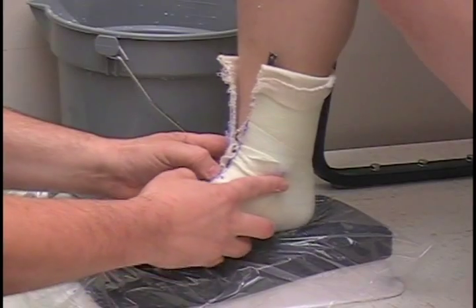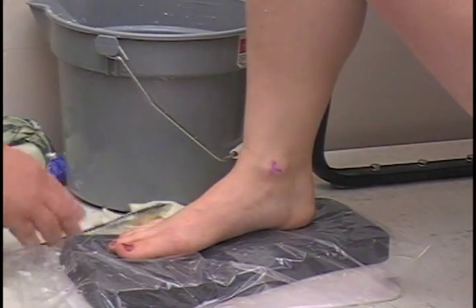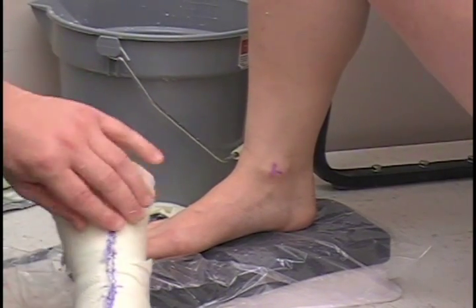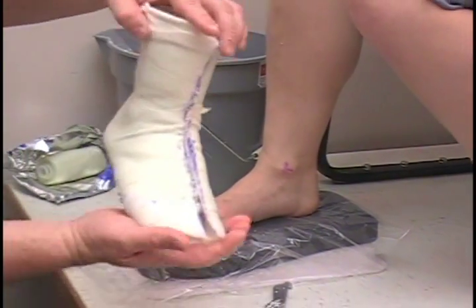All right, pull it for me — that comes right off. You want to make sure that you put it back together. Use some rubber bands to hold it for shipment, and that is your finished product.